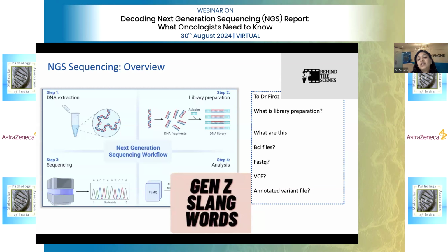This is one variability. The other variability is based on the quality. Once again, what you are saying is that I and Vindhya can't report, we need you guys only to report. That's exactly what you are telling. Yes, please go ahead. Standard guidelines have to be followed for reporting, and there are multiple parameters which the annotated variant file will give us, definitely, yes. So genome analysts are required to do the molecular reporting.